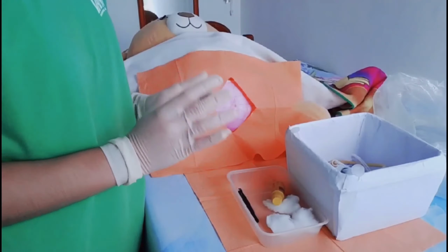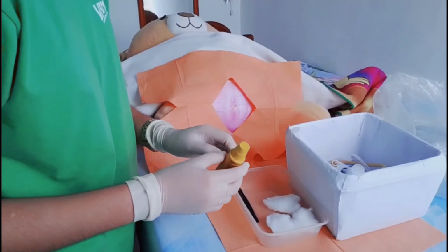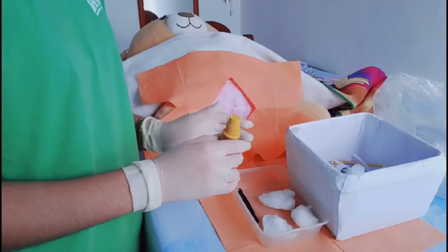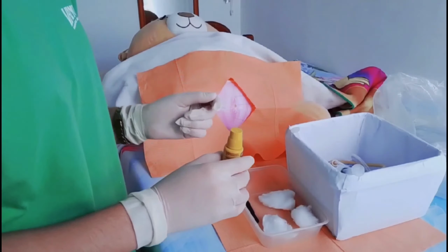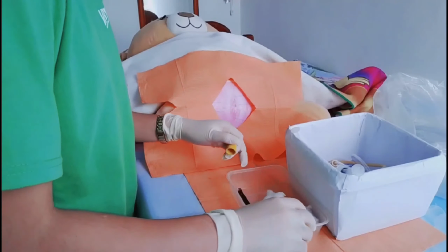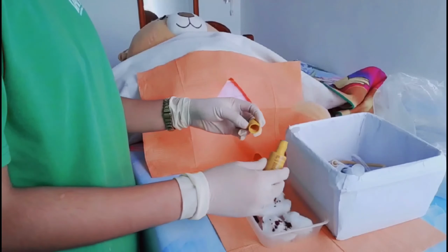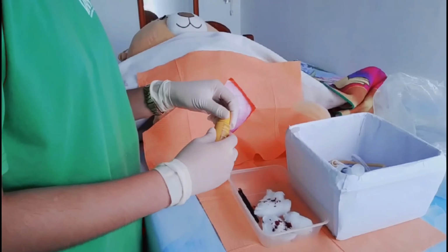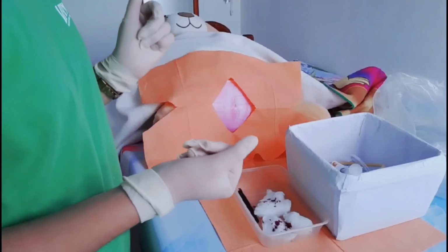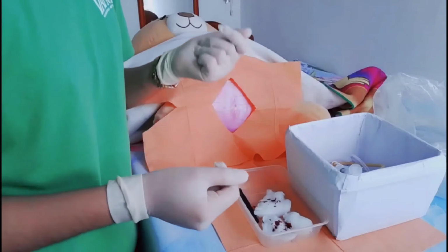Next is to fluff the cotton balls in the tray before pouring the antiseptic solution over them. It is necessary to open all supplies and prepare for the procedure while both hands are sterile. Then we're going to lubricate the catheter, because lubrication facilitates catheter insertion and reduces tissue trauma.